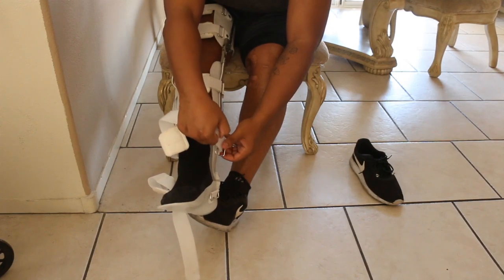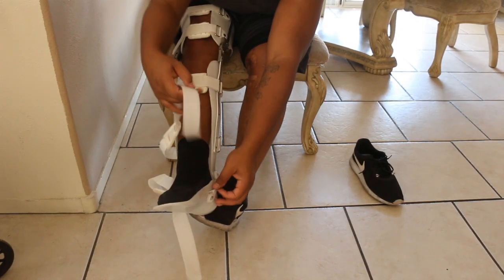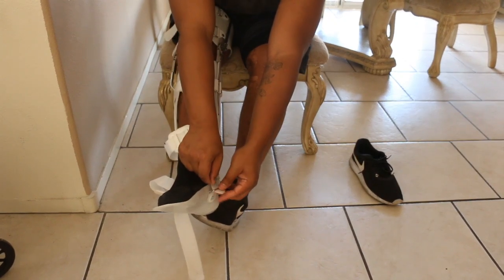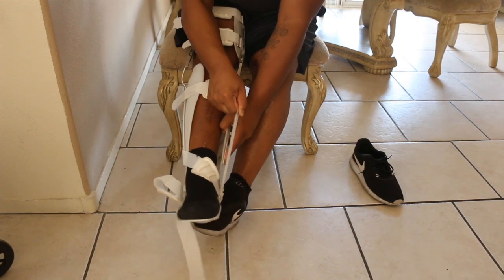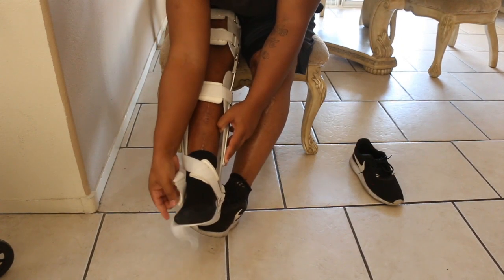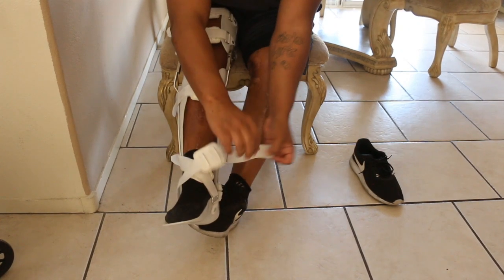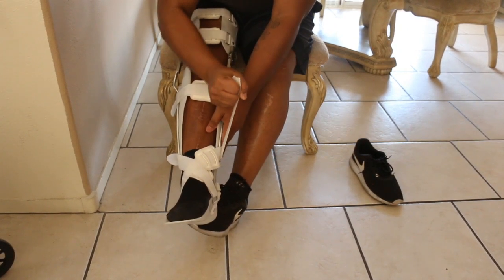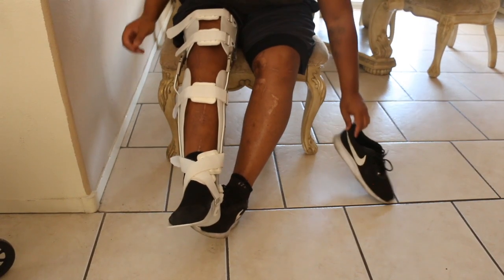There are tons of straps on this thing because it literally takes up your thigh all the way down. The last two straps always get crossed so that your foot can sit flush against the walls of the brace. You just crisscross these. And if anybody's wondering, all these scars on my legs are from road rash from my motorcycle accident.